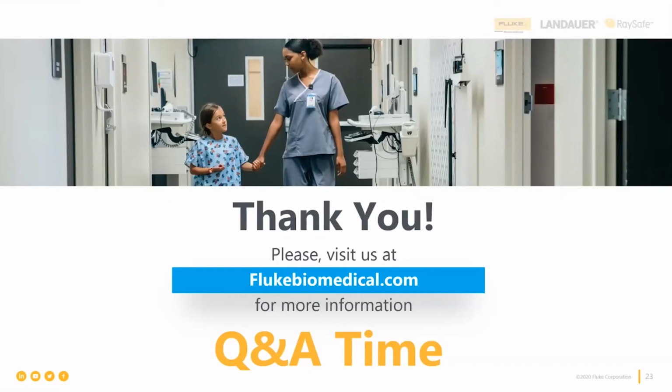So the firmware, is the firmware up to date? That's another thing you look at when you're testing AEDs. These days, you're going to look at that even if it's an ACLS defibrillator, because why? Because the ACLS defibrillators also have at least shock advisory or an AED-like function. They're not just what the doctor's going to do manually with them. Yeah. So yes, you really should be doing the testing.